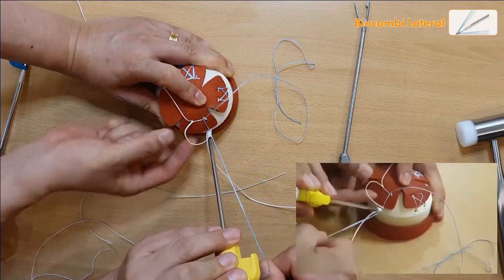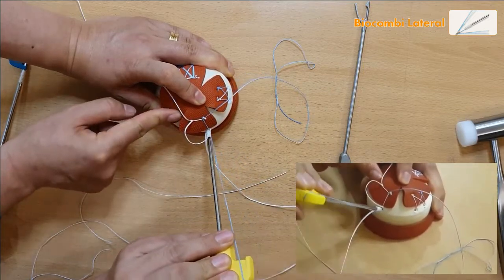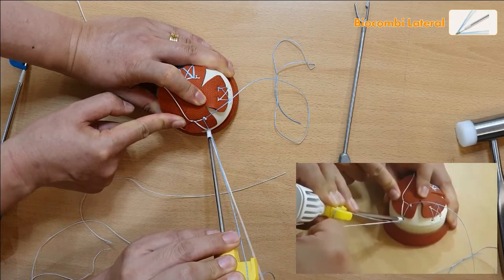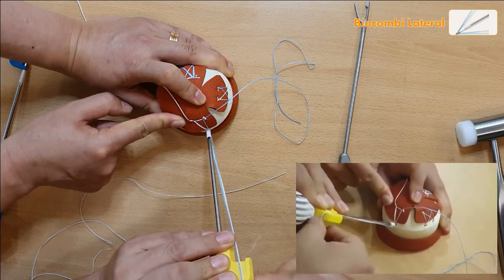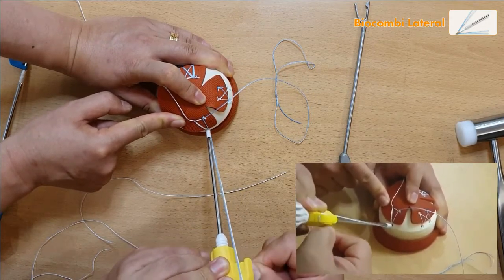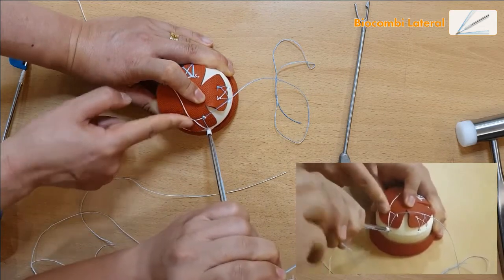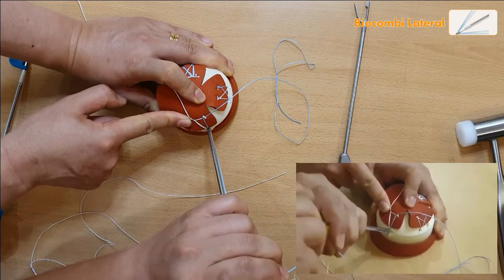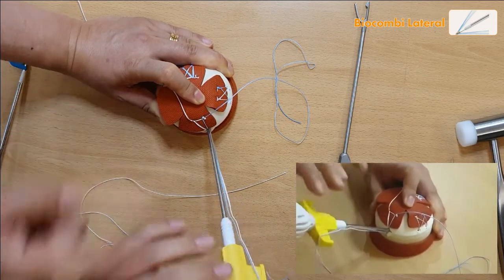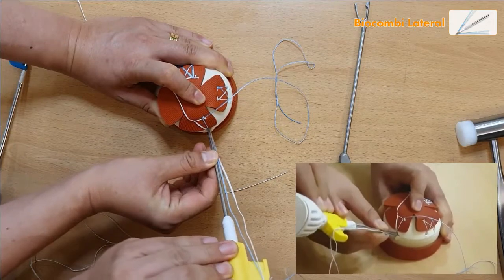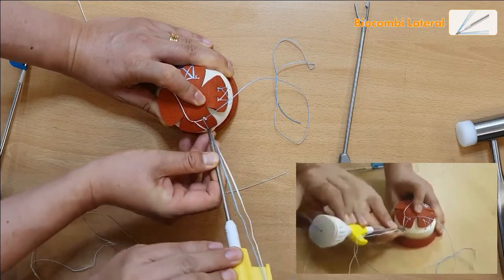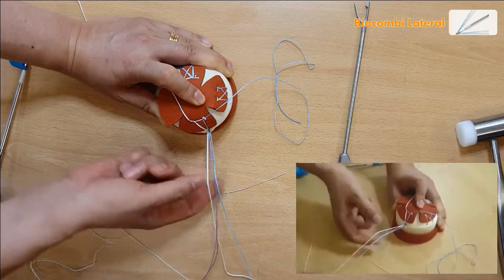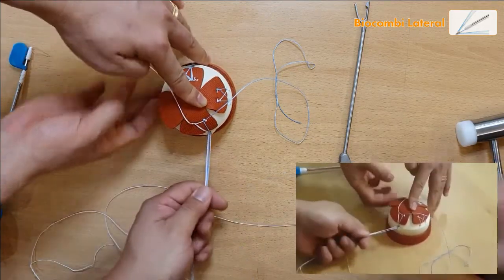Now pull it to give the tension that you want. Just lock it and screw it in and there is no more tension going on to the tissue. Remove these extra fiber wires, locking fiber wires. We'll just cut it.